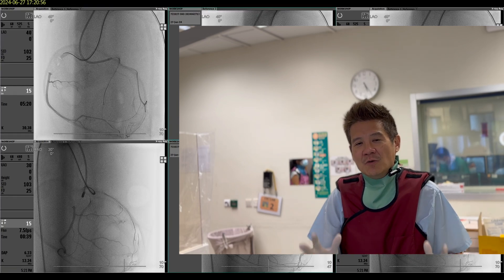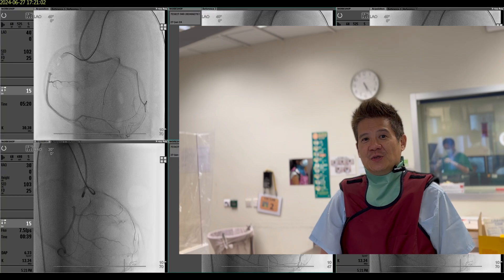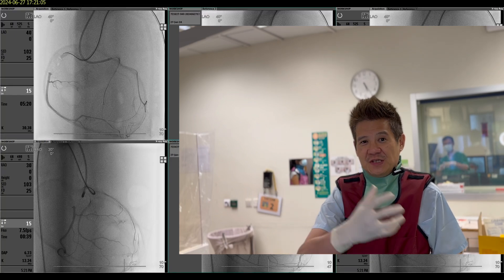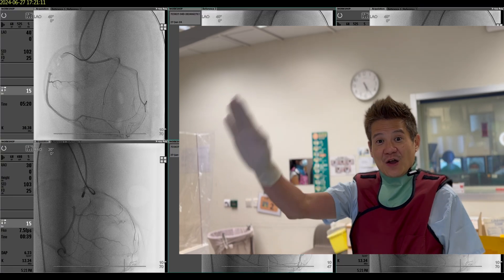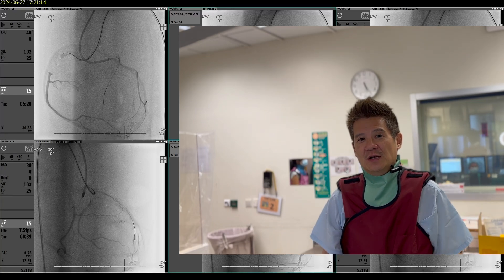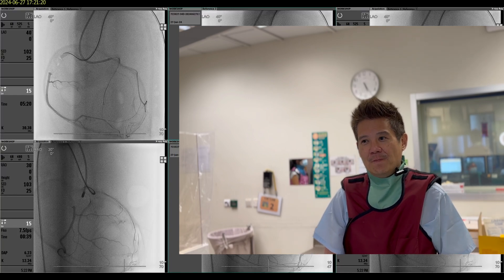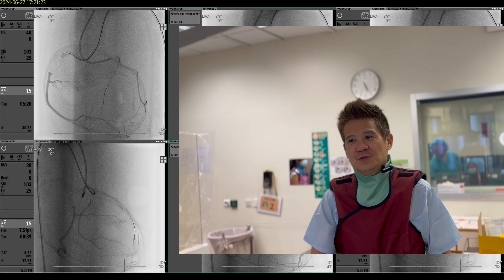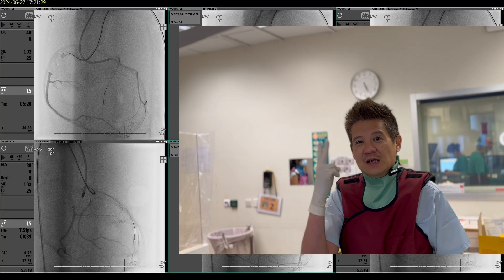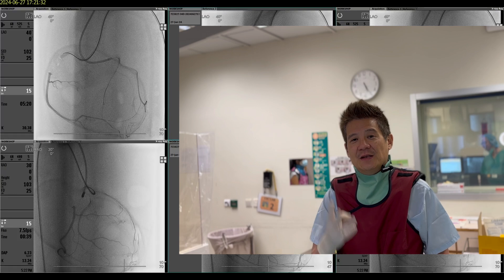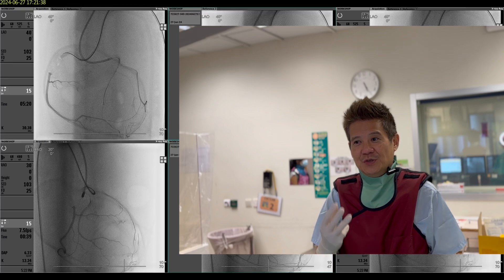Intentional intimal tracking can only be done if we have a lot of information about where the path is. Nowadays we mainly do it for ISR CTO where you can see the outside of the curve of the vessel, or in very calcified vessels where you can see the outside. In the future, if CT technology becomes very good and you can integrate the CT into your angiogram perfectly, we can do intentional intimal tracking. To do it, you need: number one, clear visualization of where the intimal path is; number two, clear visualization of where the distal cap is; and number three, a high-penetration-force directable wire with good backup support.